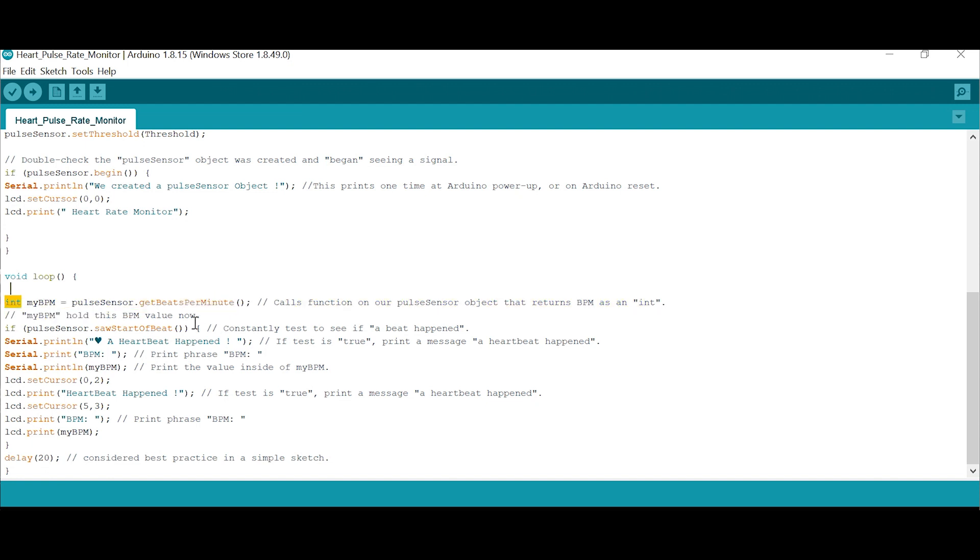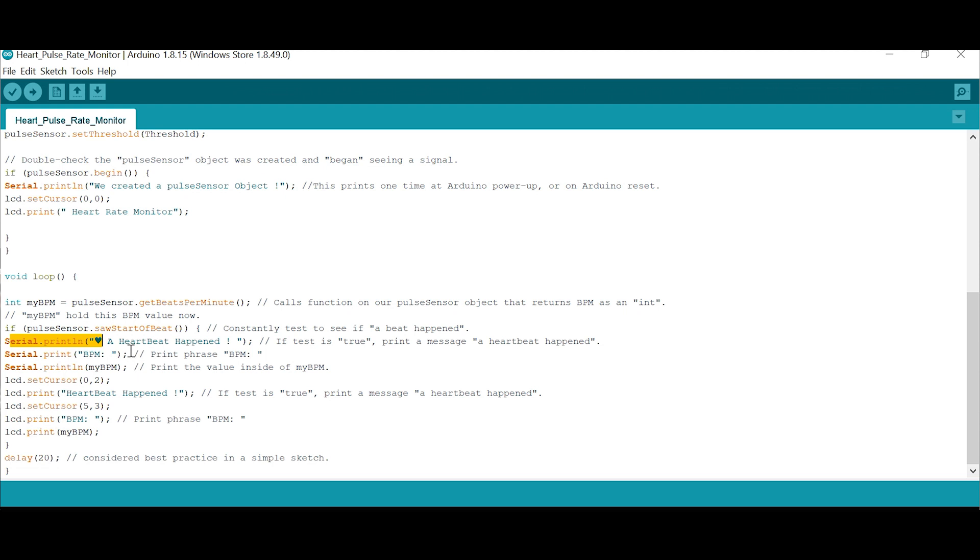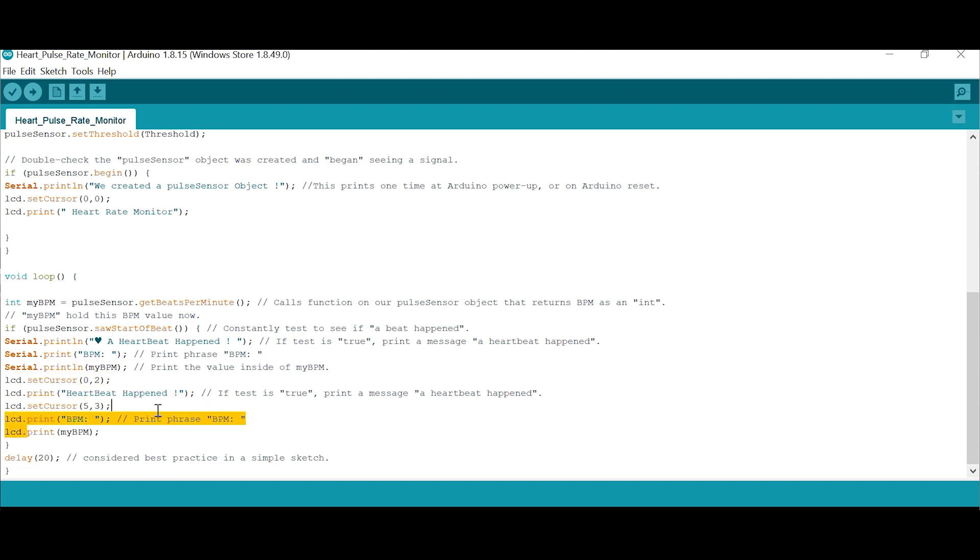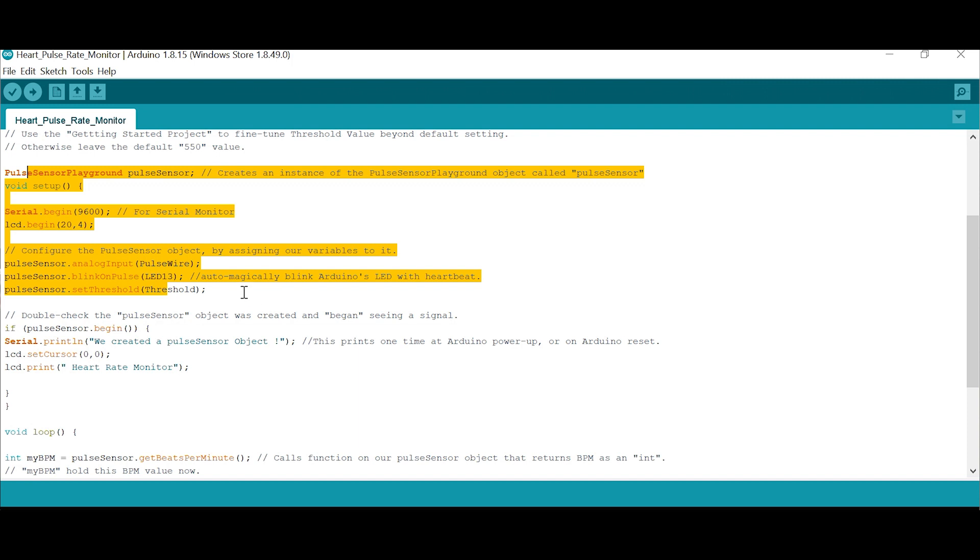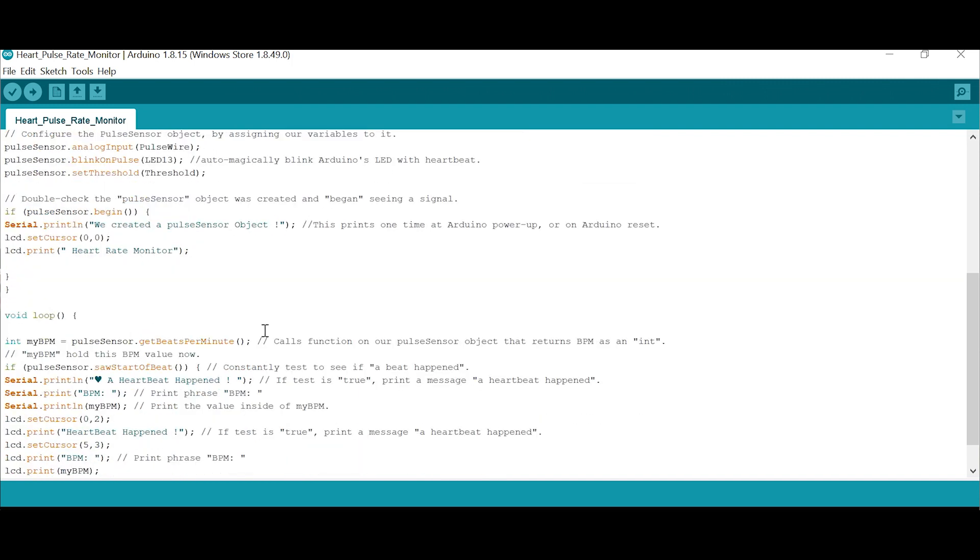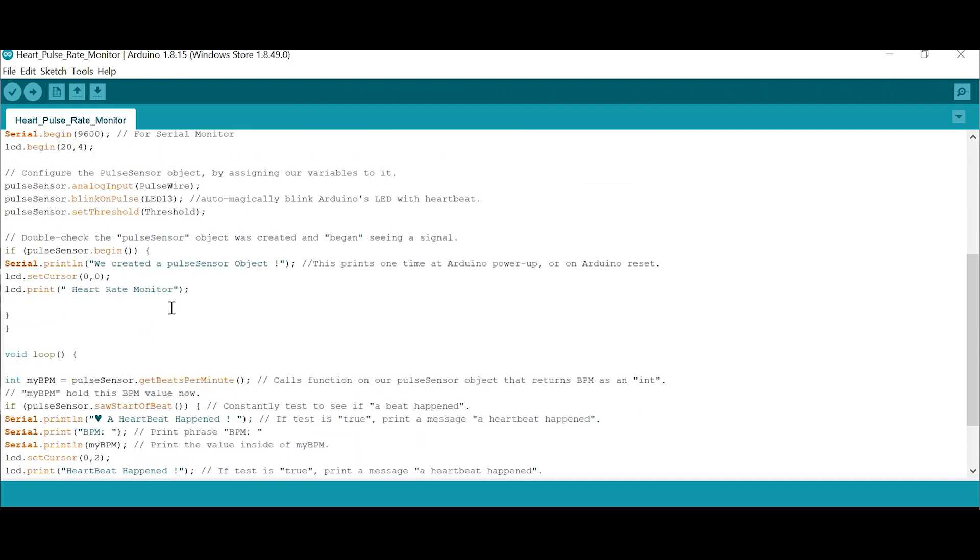Get the beat per minute. Pulse sensor serial print - start of the beat. So it should find the start of the beat. Somewhere it has to reset, and again and again it will find out BPM. That's the heart rate. This is the main program. This is the serial code setting and this is the variable setting. Very simple.